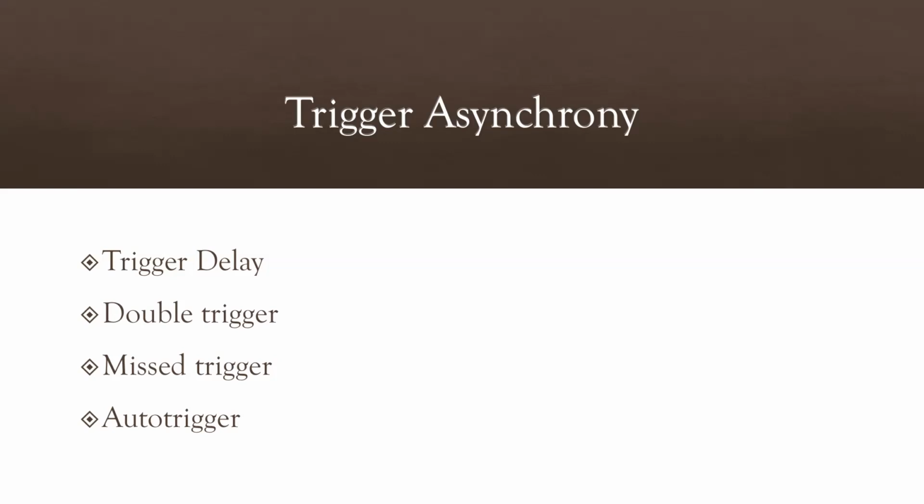So you'll see them breathing in and they're not getting a breath, and that's why. We talked about double trigger. They want more tidal volume.